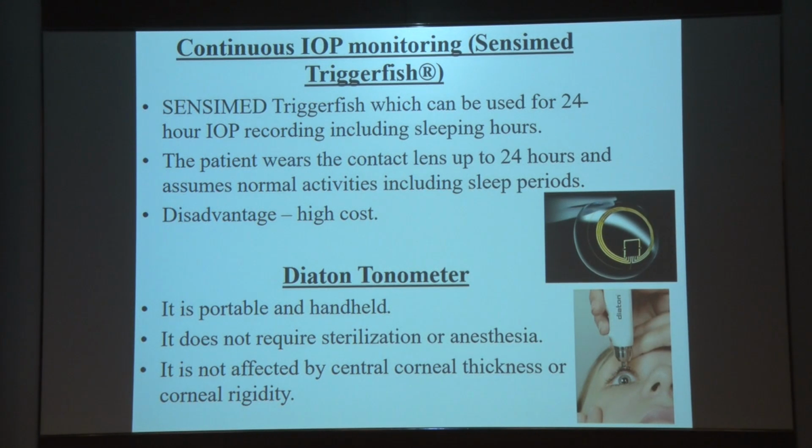This is a new thing, which is continuous IOP monitoring by Triggerfish. Sensing by Triggerfish can be used for 24-hour IOP recording, including sleeping hours. The patient wears the contact lens up to 24 hours and assumes normal activities, including the sleep periods. The disadvantage is very high cost right now.